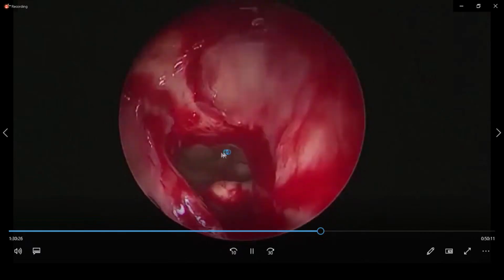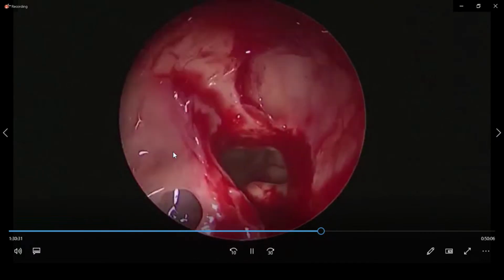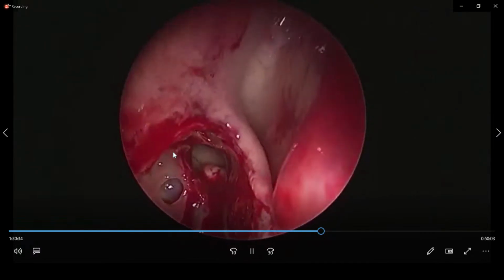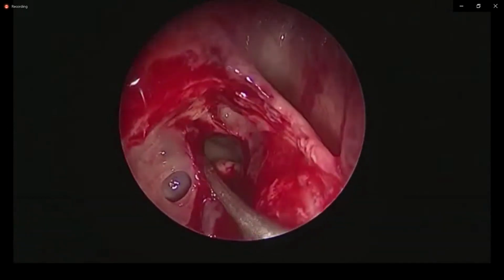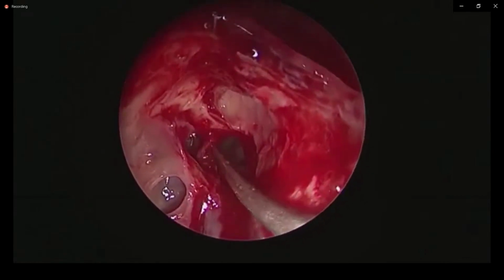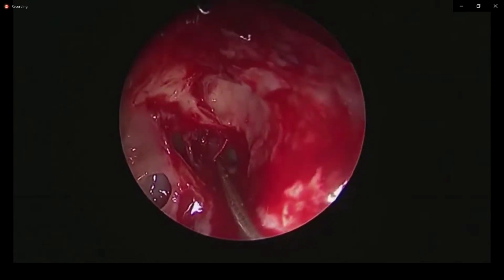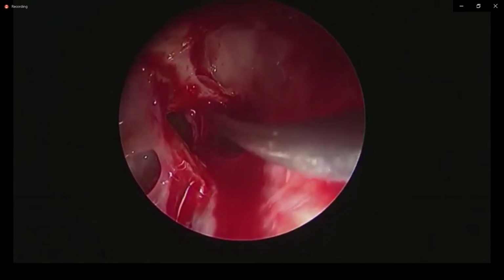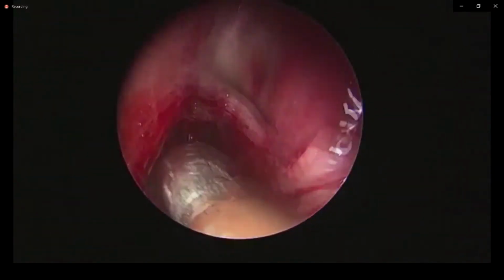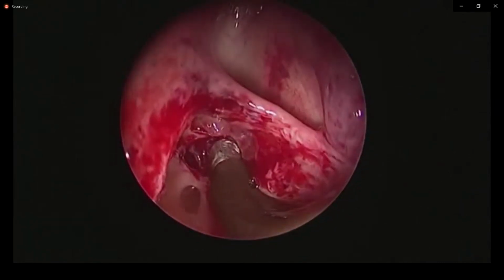Can you see now? Yeah. So this is frontal sinus. This was the party wall, which is fractured and needs to be removed. So what you need to do is remove this party wall. See, this is the party wall. Can you see again? Yeah. Remove this and widen the frontal sinus drainage. That's the septation. That is the cell. And this is how CT scan is useful. The 70 degree scope is useful. You can remove that party wall, widen it to give a good frontal sinus outflow.